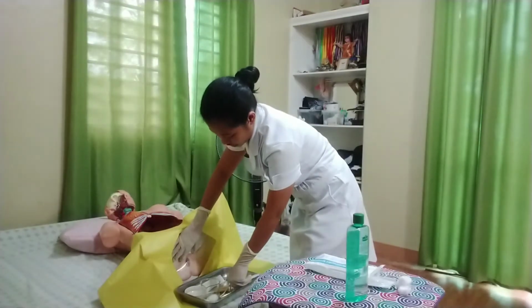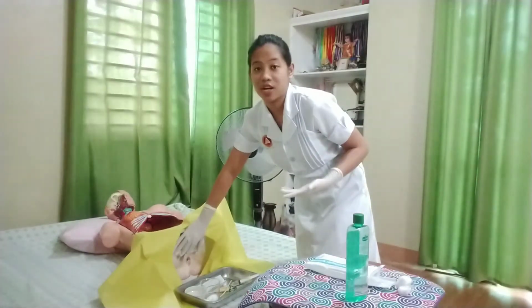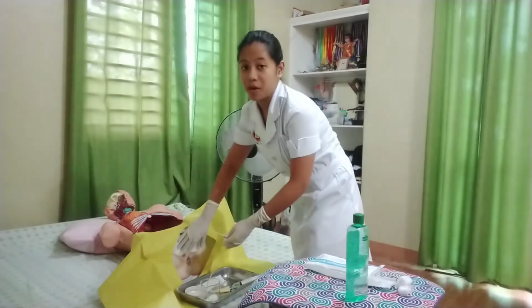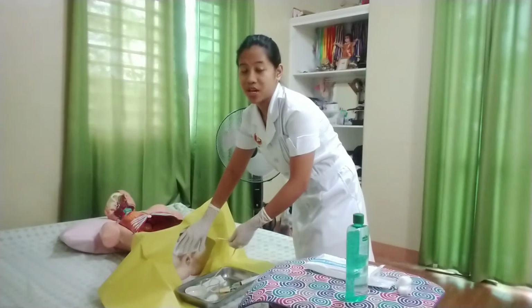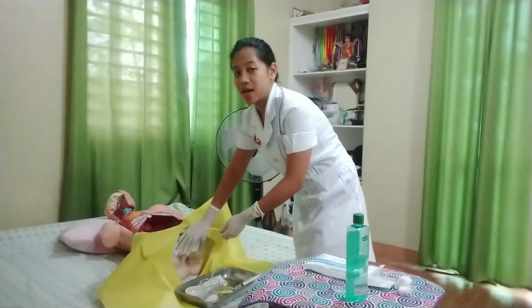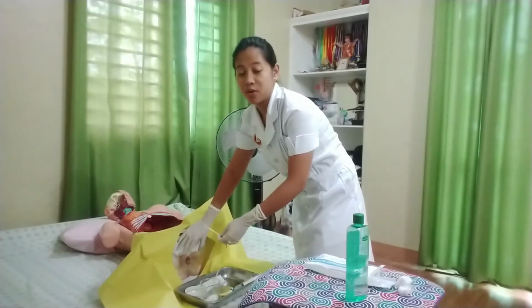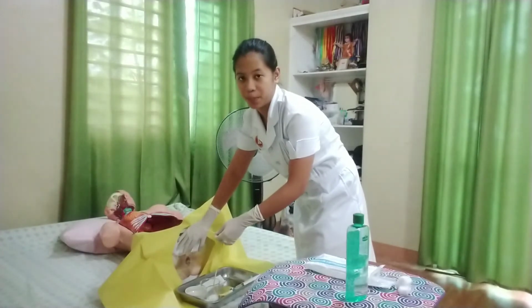Now that we are already done cleaning, we will insert the tip of the catheter into the meatus for about 2 to 3 inches. We should always remember that we should not use force to push the catheter through the urethra into the bladder. Instead, we will ask the client to take a deep breath and rotate the catheter gently if slight resistance is encountered once the catheter reaches the external sphincter.